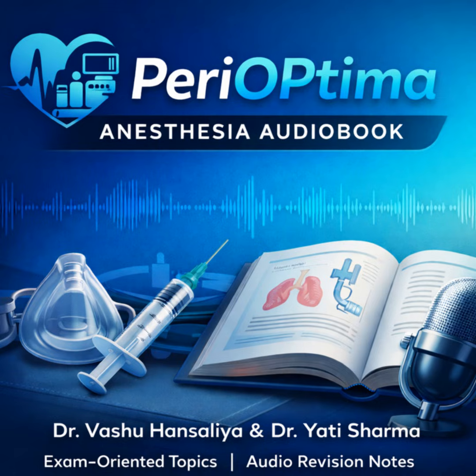So if the O2 flush is activated for too long, or continuously while the patient's circuit is closed or partially obstructed, like during inspiration, or if the APL valve is shut tight, the extreme pressure surge can easily lead to barotrauma. A collapsed lung. Pneumothorax, yes. And this risk is especially high in neonates, pediatric patients, or any adult with very poor lung compliance. It's a powerful tool, but one that requires immense caution and control.